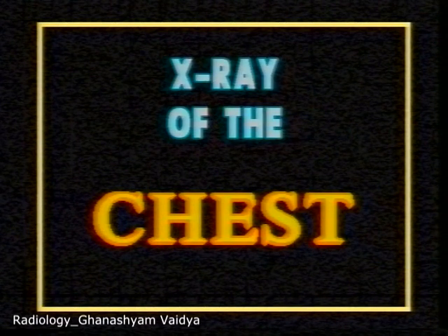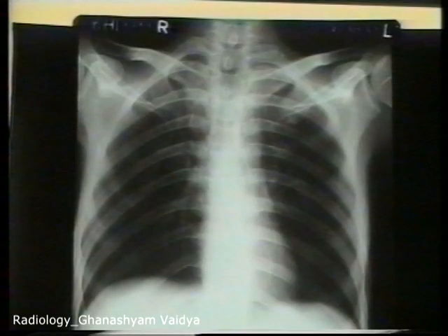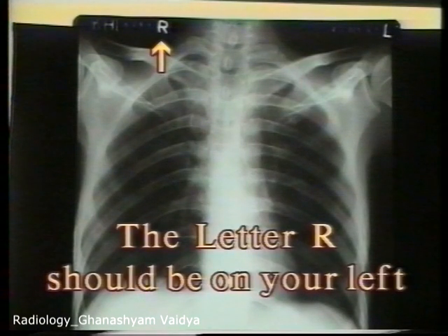X-ray of the chest. The first step in reading an X-ray film is to hold it correctly, upright and with the letter R on your left side, as if the patient is standing facing you.